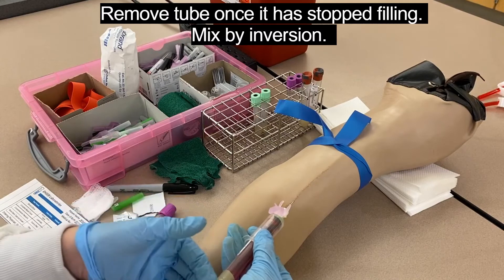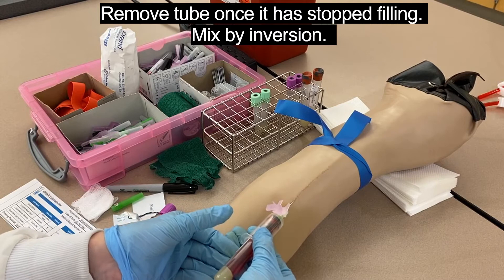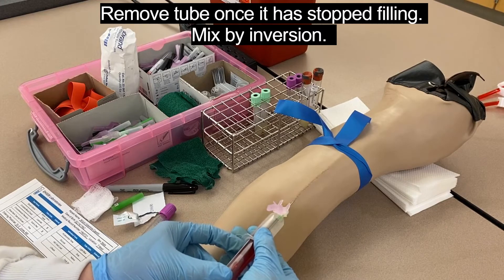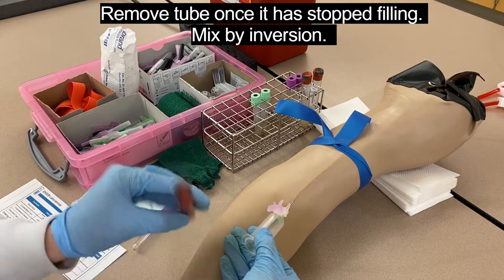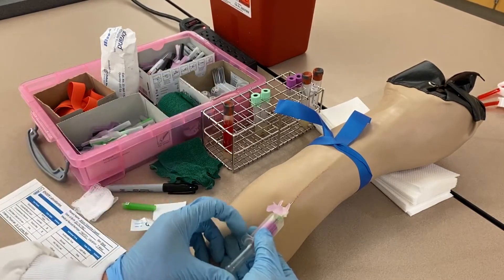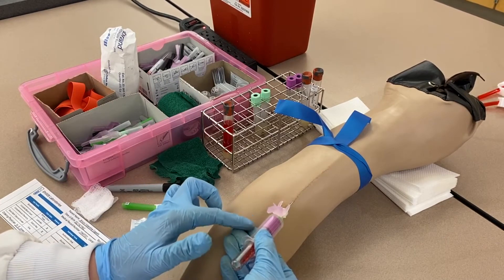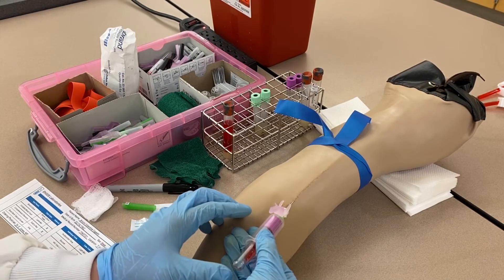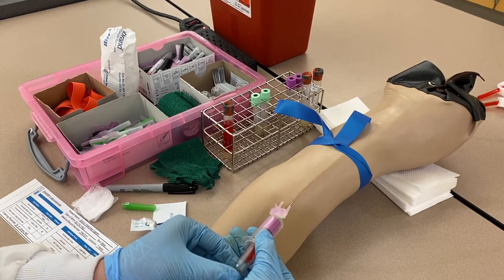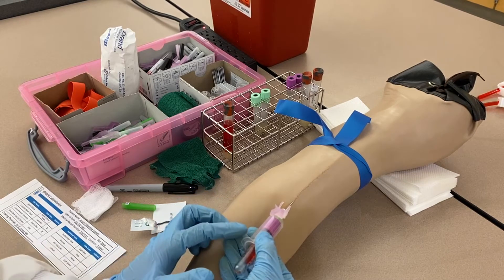Once the tube is done filling, to pop it off I grip it between my middle finger and thumb, then use my index finger to pop it off against the base of the tube holder — like a pinching motion. Invert it, then push the new tube on with that same pinching motion, always keeping my fingers resting against his forearm. If I was concerned about a vein issue, I could slowly move the needle forward and back by moving my thumb.